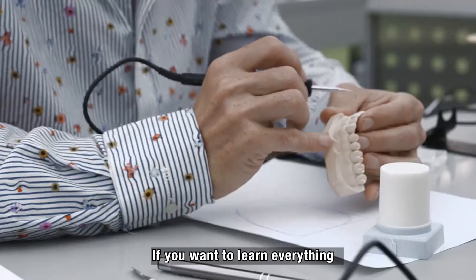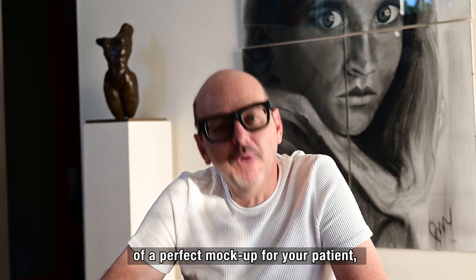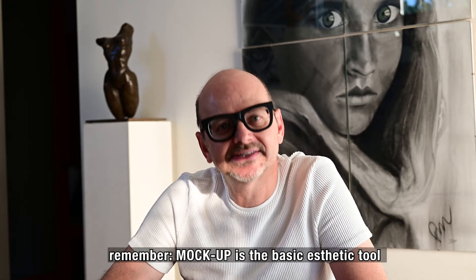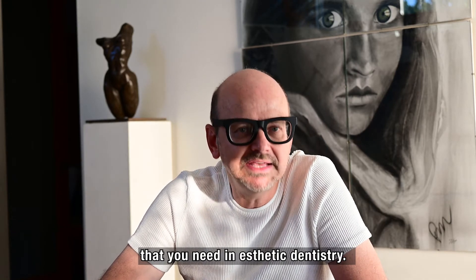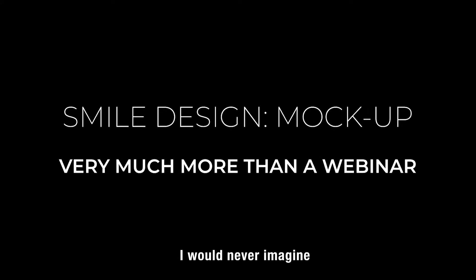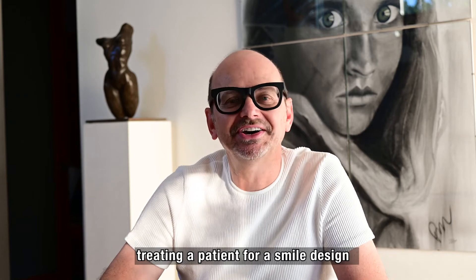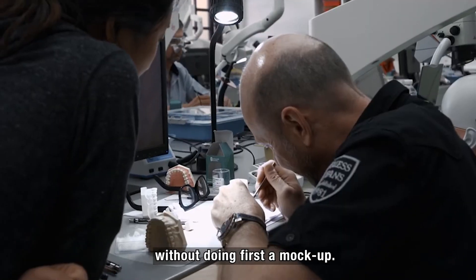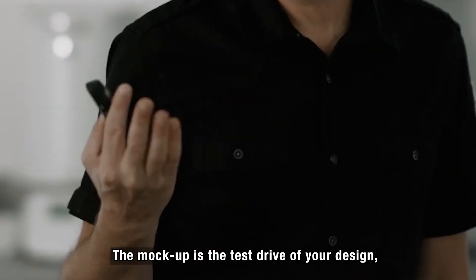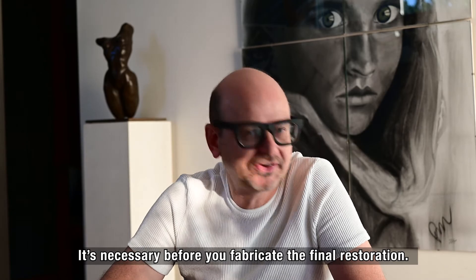If you want to learn everything about the fabrication of a high-end mock-up for your patient — remember, the mock-up is the basic aesthetic tool that you need in aesthetic dentistry. I would never imagine treating a patient for a smile design without doing first a mock-up. The mock-up is the test drive of your design. It is necessary before you fabricate the final restoration.